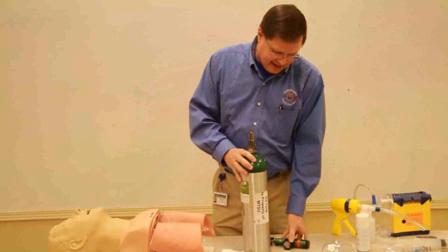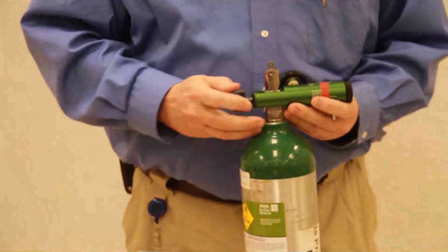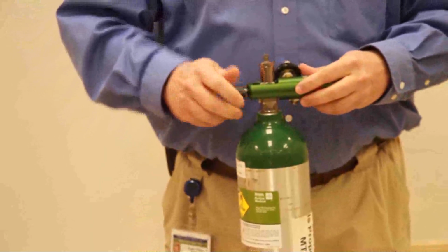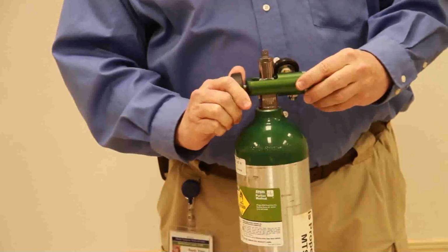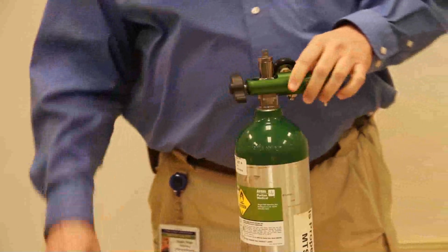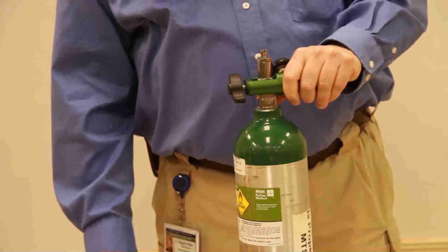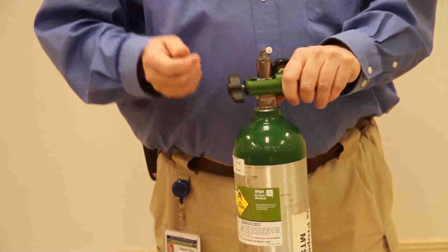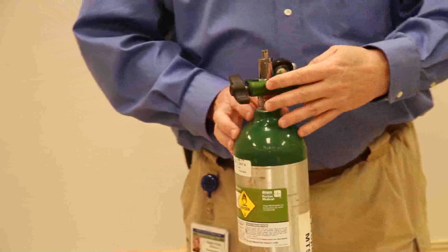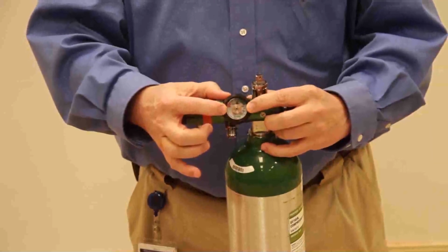Now, the next thing is we're going to take the regulator and we're going to place it on the tank and we're going to hand tighten the screw that is in the back to make sure that we have the oxygen regulator on. All right? Now what we're going to do is we're going to open the tank to make sure that there are no leaks, and we bring the tank about 3/4 of a turn open, should be fine. To make sure there's no leaks around, okay, and we are going to check our gauge to make sure that it reads full.